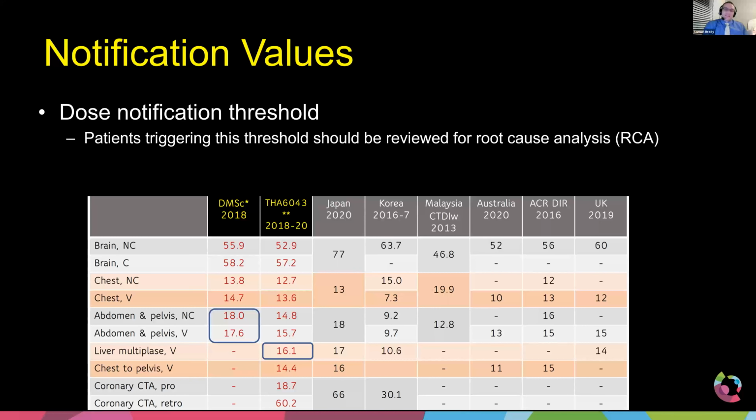Yeah, and that's very true, because ultimately, wherever you are, high or low, you need to look at your image quality, as was just said, and then you obviously need to ask the question: am I getting the right diagnostic information? And so at times there is a reason to go a little high.